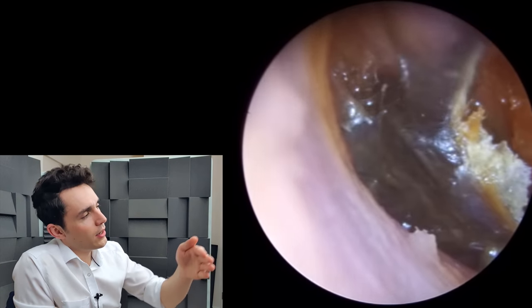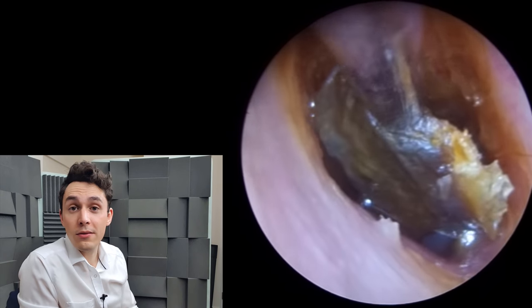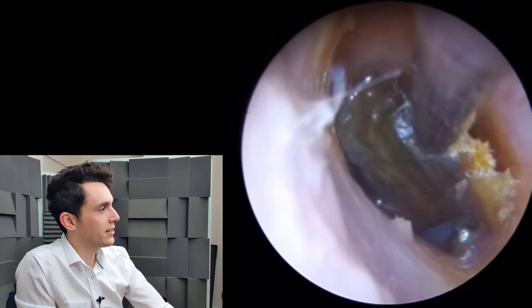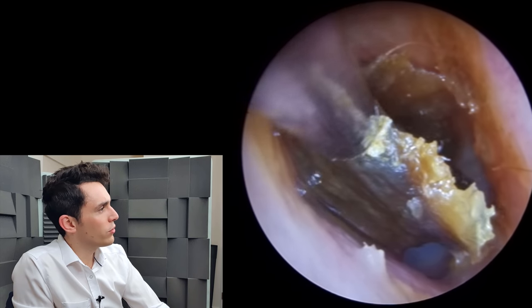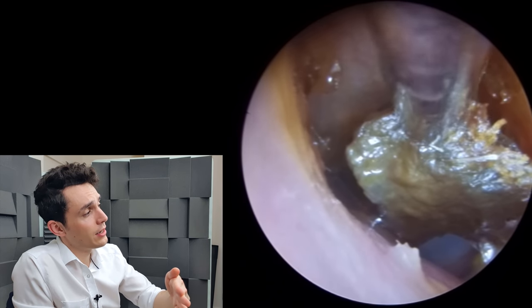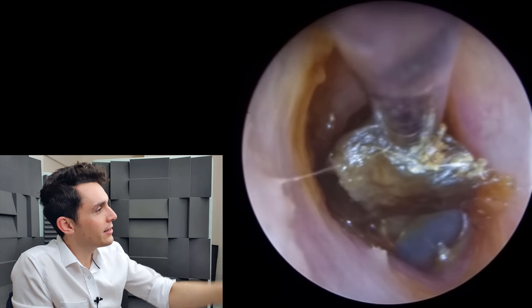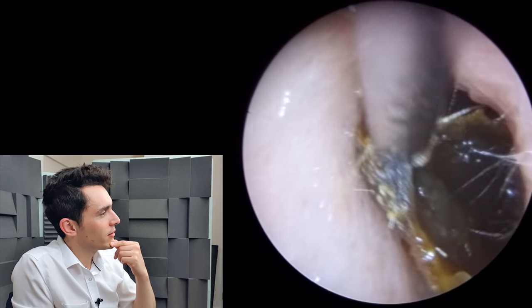Because I've edited the video, it looks like it wasn't too difficult a case, but I did spend quite a lot of time off camera — which has been edited out — just getting a feel for it and probing and assessing the situation. So this is a best-case scenario here. Now that I'm pulling it out, it is a very awkward shape. The back end of the plug was in contact with the eardrum but not adhered, which is probably why the patient was able to tolerate the procedure. I can see it's still anchored down there — pulling it out — and at this point it gets trapped. It's just an awkward shape.